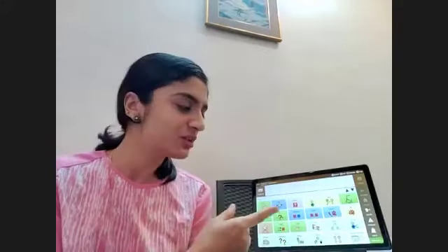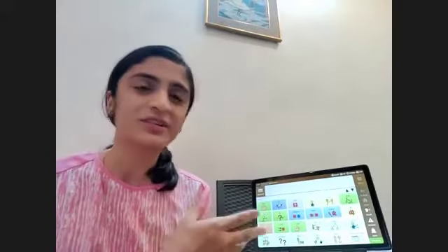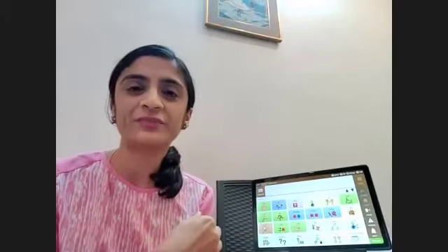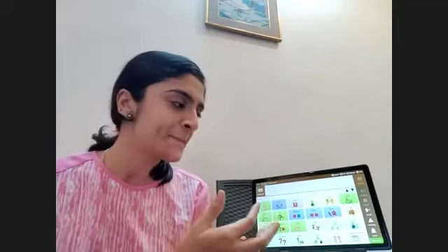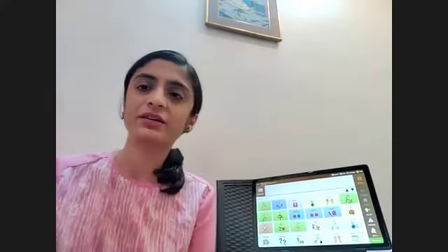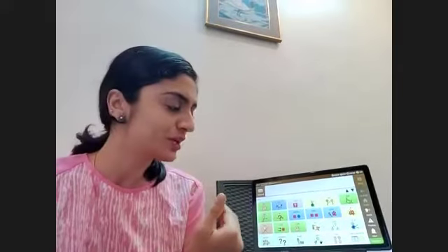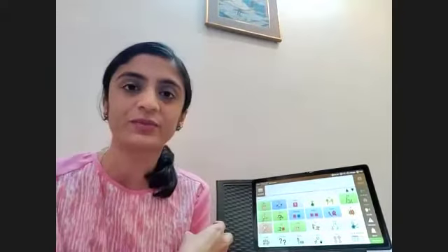So they need to learn to go and find it according to where it is in the Avaz. And you will see that it took me a while too to find it. And I think as parents or family members, sometimes we think that, oh, okay, maybe we'll just put it all in one place. It makes it easier. But the whole approach is to use all of these different folders, so we understand that it fits into all of these different concepts or categories. So you don't need to create separate folders.